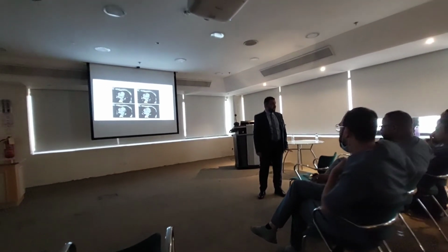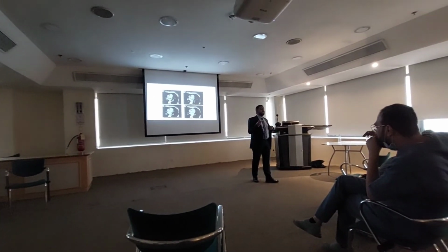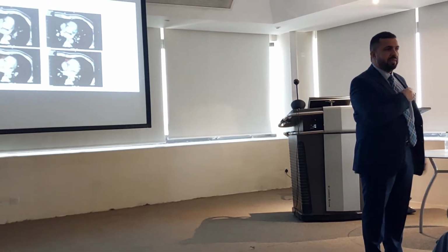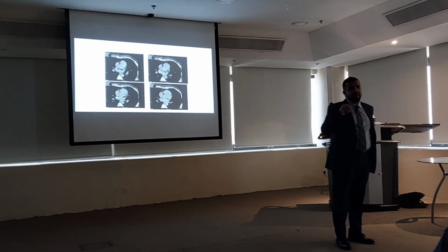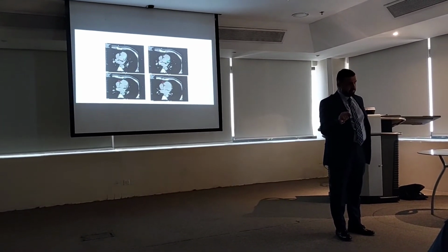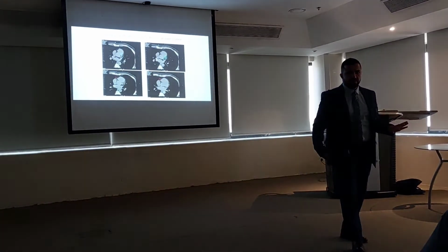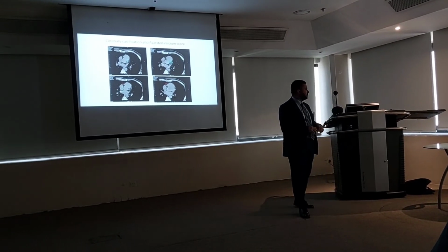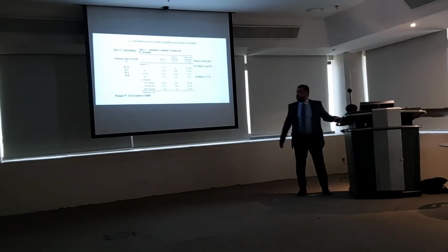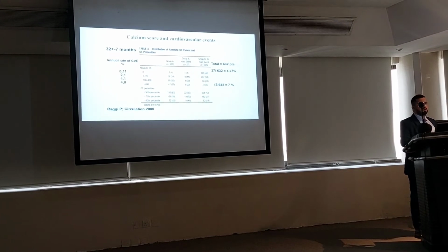That's because there is a lot of calcification all over the coronaries, or a lot of calcification localized in the main bifurcation and circumflex. The reporting doctor will have enough experience, and I'm sure this one will not be able to be diagnosed by CT scan. So because of that level of calcification we will move to angiography. Now this is an example of the calcium scoring report. It will show you which group you are in from statistics.